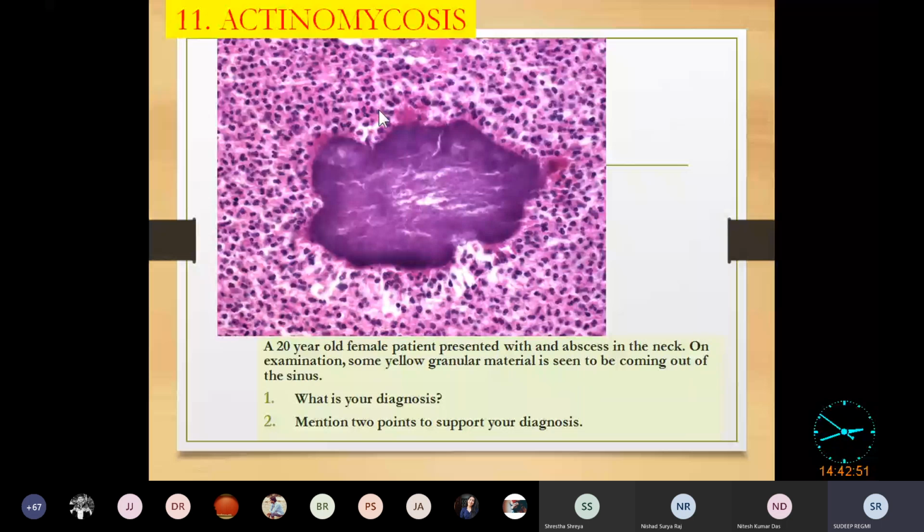You can see the segments of the neutrophils. It is not seen like what you see in the hematology slides, like the peripheral blood smear, because this is a biopsy section. Okay, so you can see these are neutrophils. This is sheets of neutrophils. So this is an abscess. Okay, and the rest?